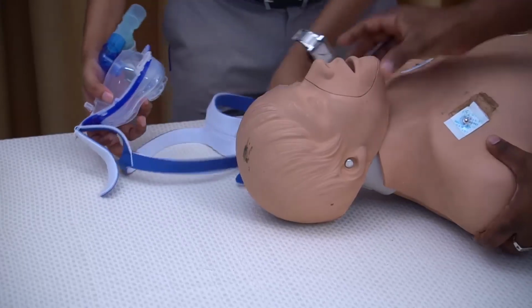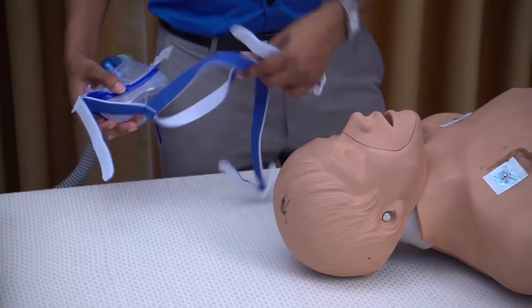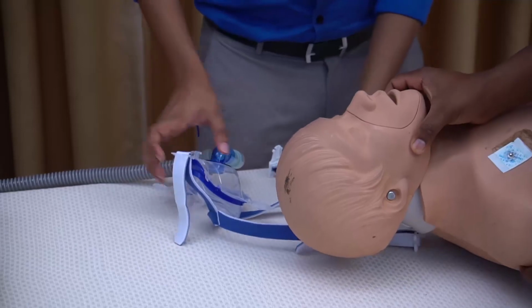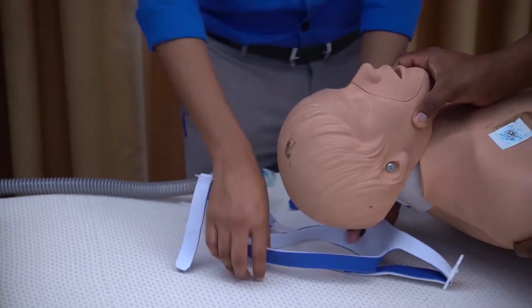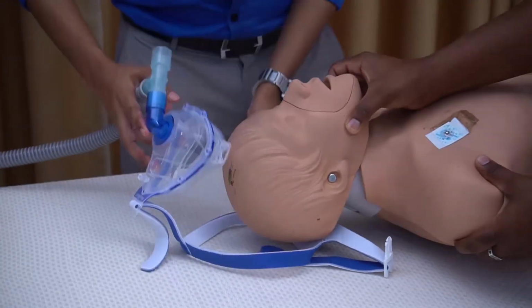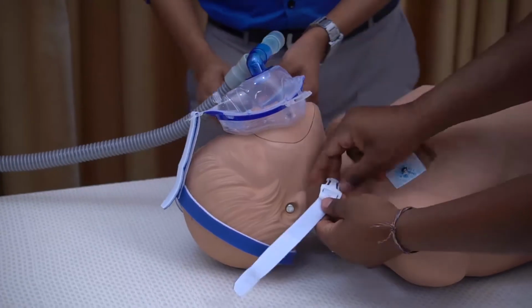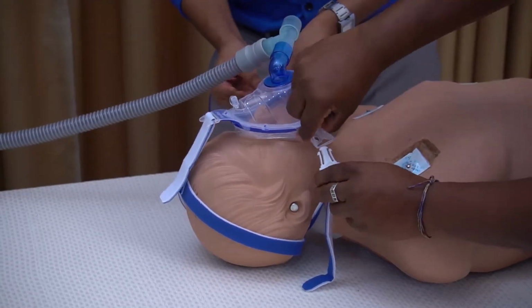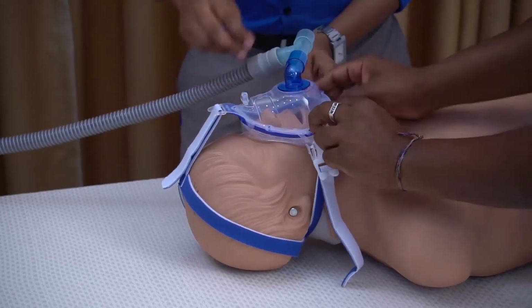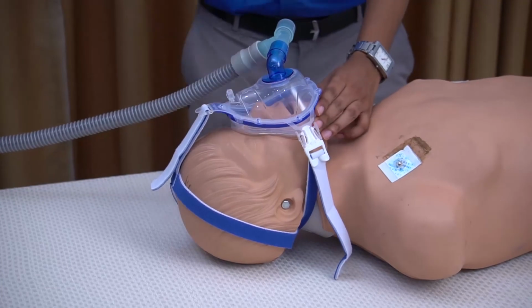CPAP harness. This is the CPAP harness. This is used to fix the mask to the patient. The main part of the harness is placed behind the head of the patient, and then the mask is fitted using the straps of the harness as shown here. If there is an air leak, it should be corrected by adjusting the straps.